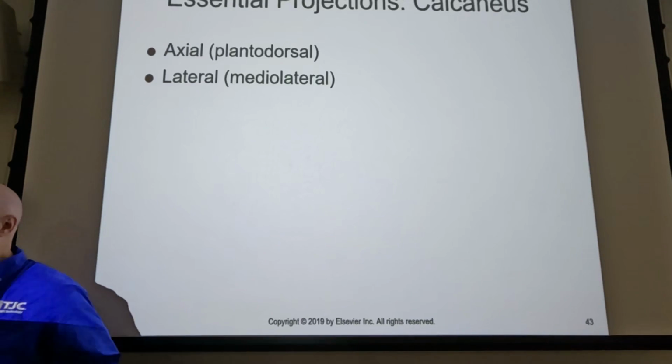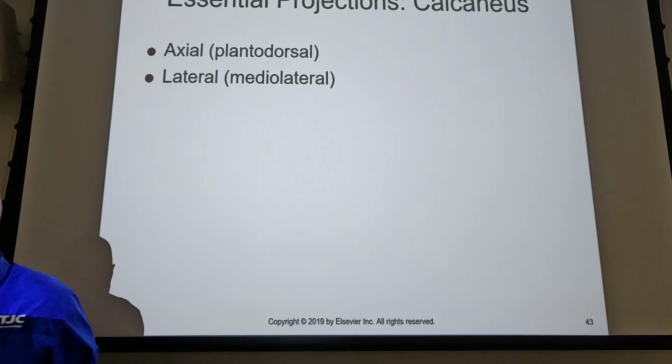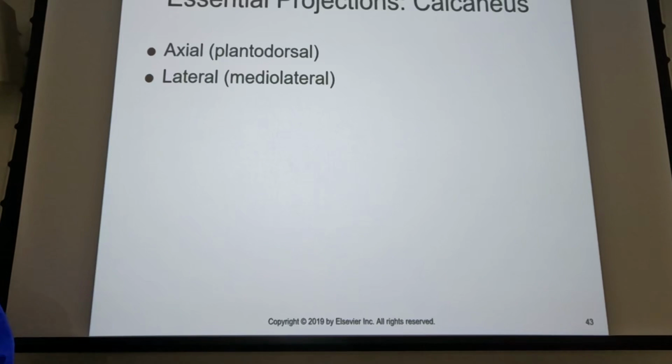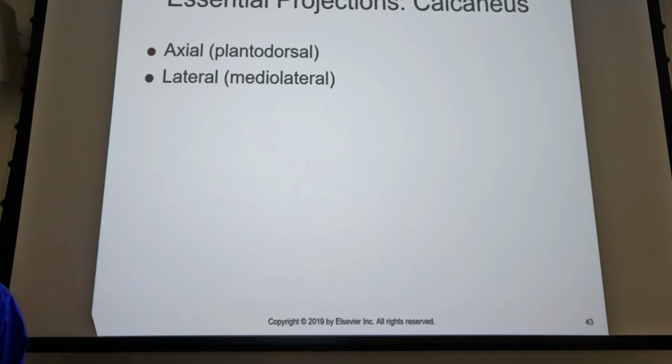Play with your machine, see what the limits on the angulation are, but a lot of the machines I've used, you could not get a 40 degree angulation. It would automatically keep you from making an exposure, not shut it all the way down. Just thought you didn't know what you were doing, I guess. So tabletop, 40 degree angulation.